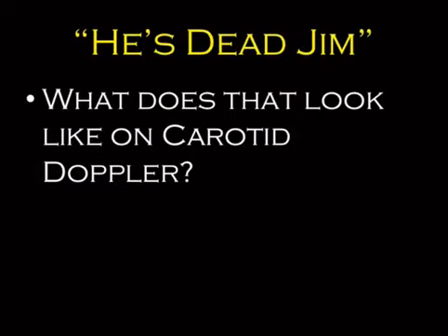So what does brain death look like on carotid ultrasound? In Europe, I've been told that they do actually do brain death studies occasionally with ultrasound, carotid ultrasound, just like the nuclear medicine brain death study that we have here in the States, which basically shows no blood flow through the internal carotid. It's all external carotid.